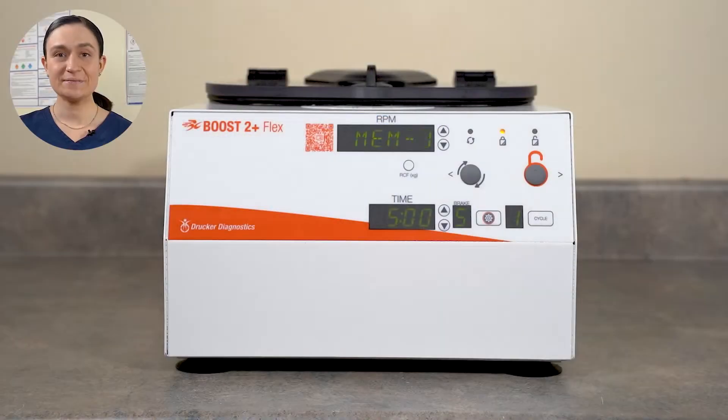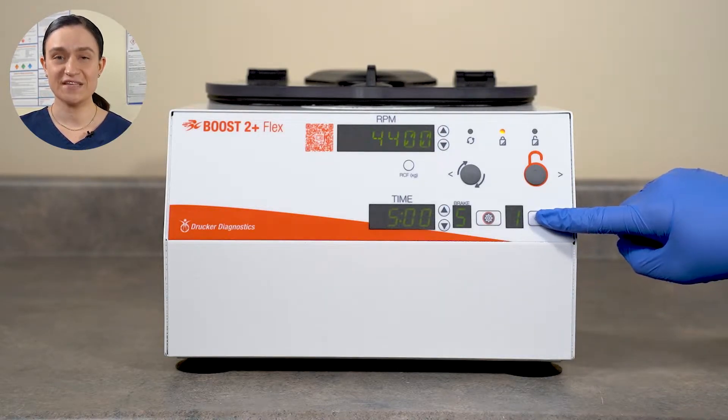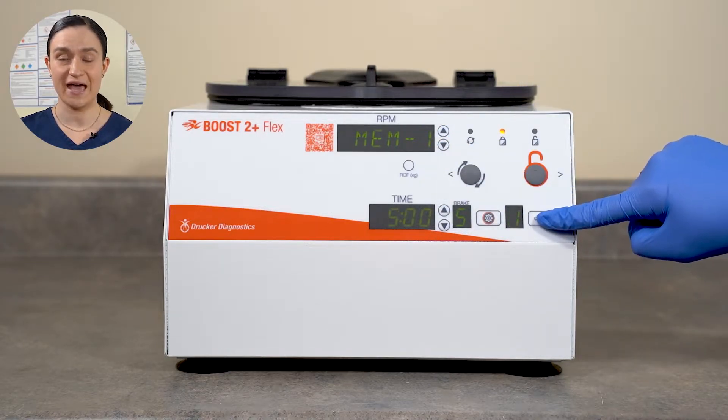In Presets Only Mode, your Boost 2 Plus Flex can only spin saved, programmed cycles. Only saved cycles can be run — no settings can be changed, free mode is inaccessible, and no new cycles can be added. This video will show you how to engage Presets Only Mode.